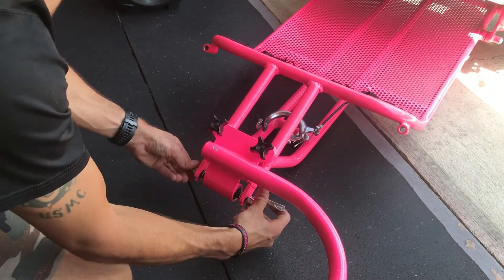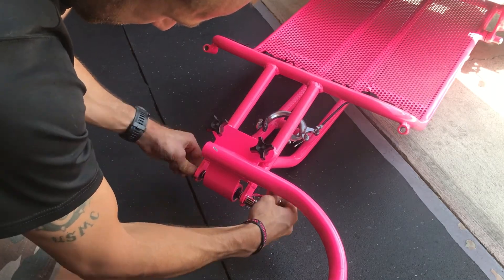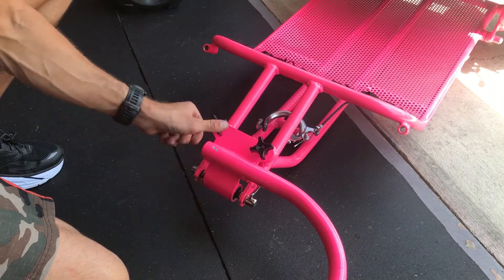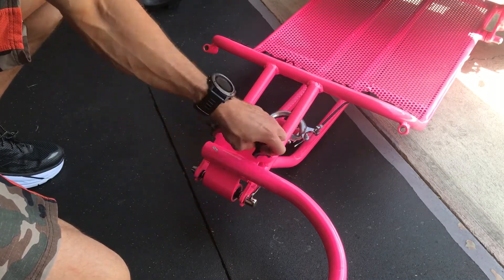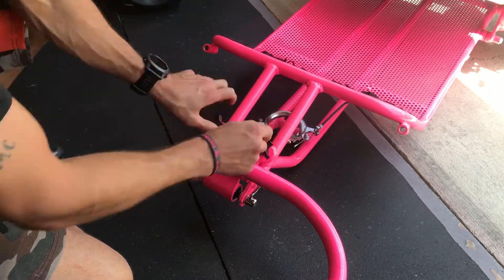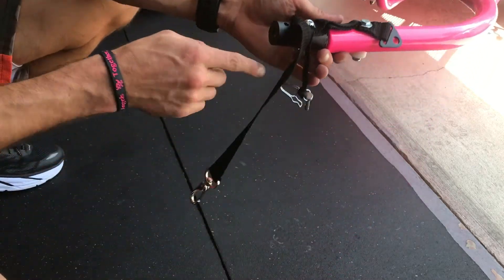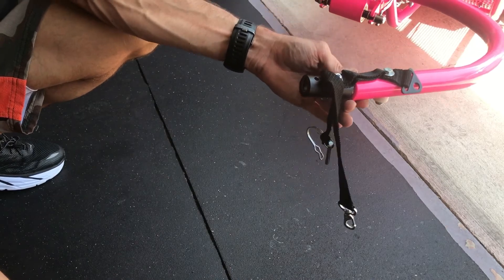Tighten those all the way down, then reinsert the rod just like you would on your bike — make sure it's as tight as it'll go. Between the rod being as tight as it can go and those screws all the way down, that's what keeps it secured to the actual chair. That's secured and not going anywhere. The next step is actually hooking up this female end to the male end which we put on the bike a moment ago.